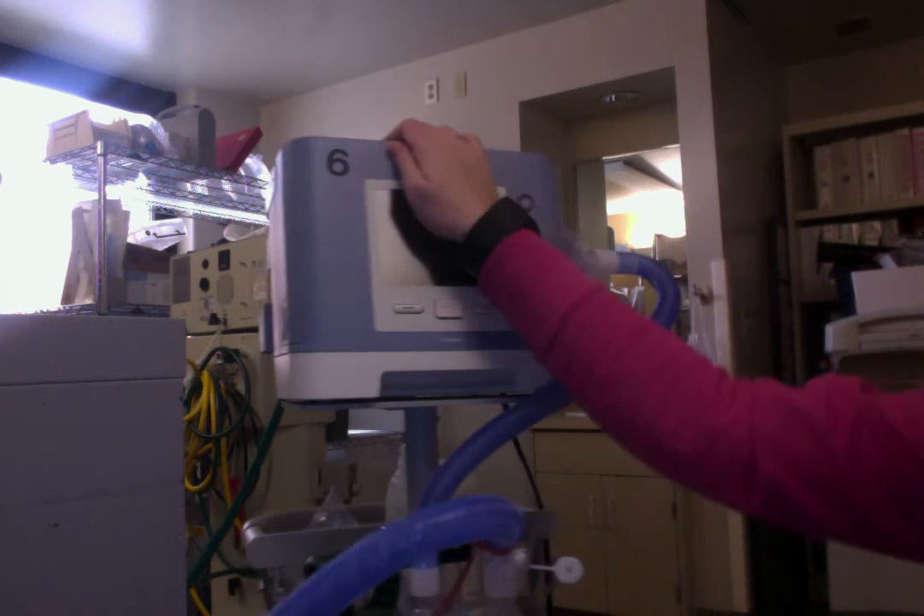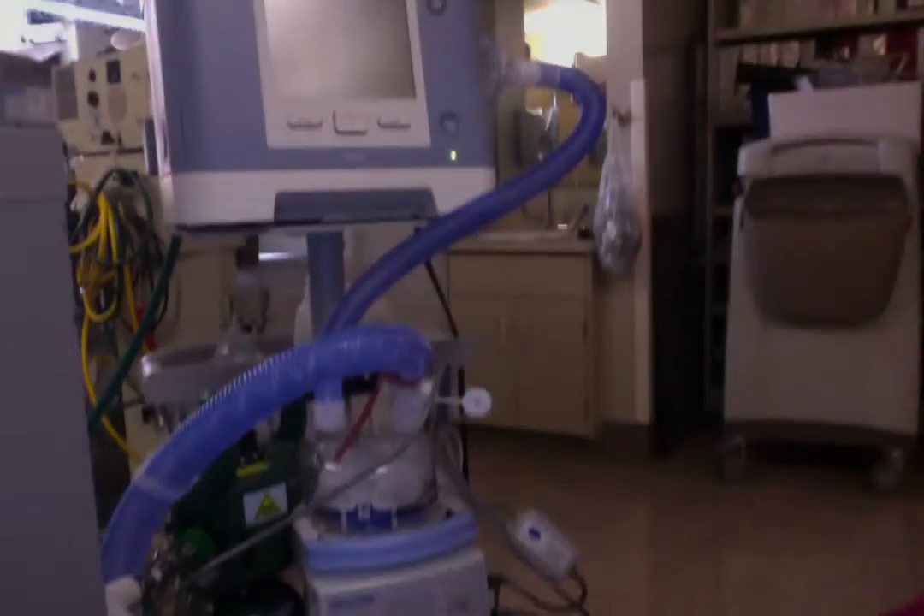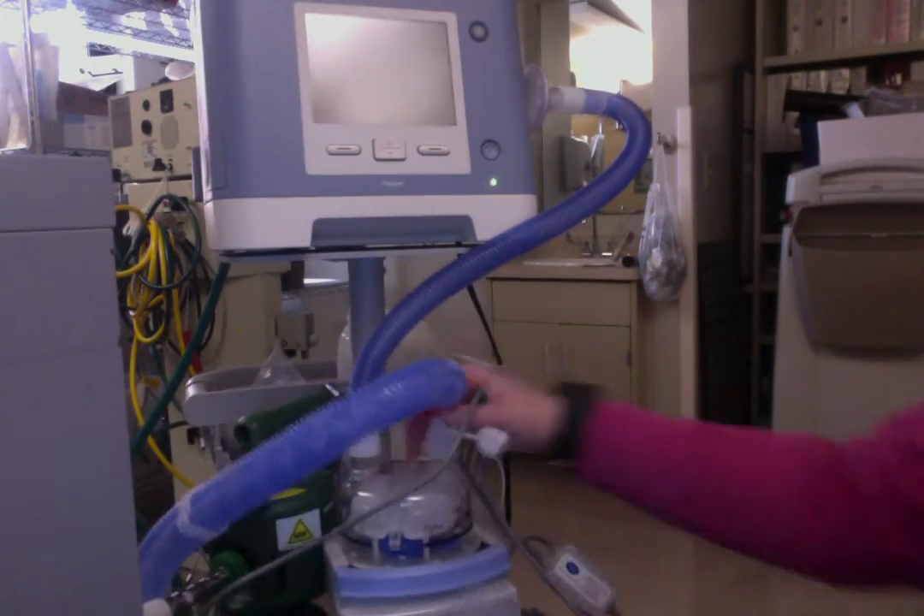So I have my Trilogy BiPAP here. The setup is really simple.